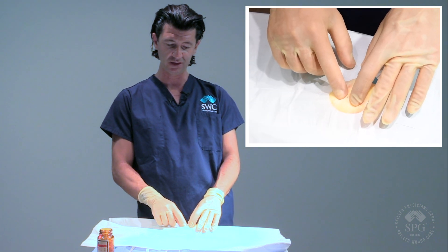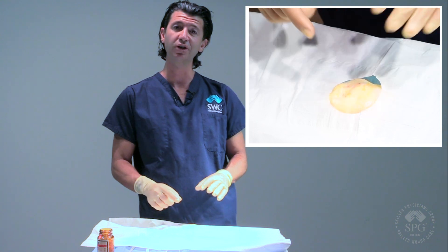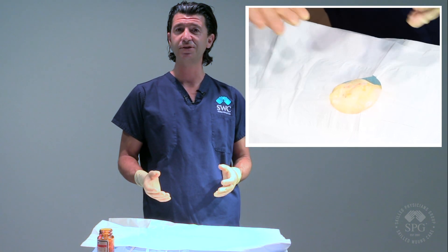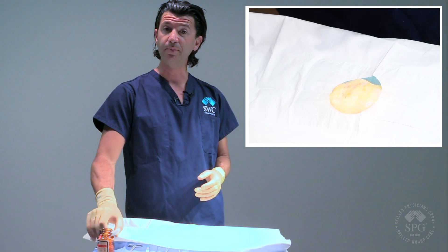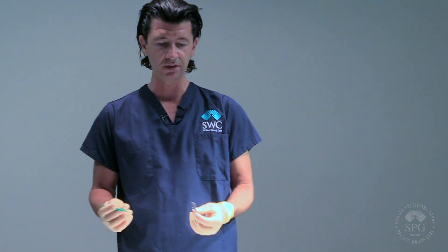Already you can see some of the fluid coming out, which should look like purulent debris or pus. In this case we've used liquid butter for our demonstration. Here I have a scalpel — scalpels come in different tips. In this case this is a 10 blade, and I'm going to be using it along with pickups, which are basically forceps — those terms can be used interchangeably.